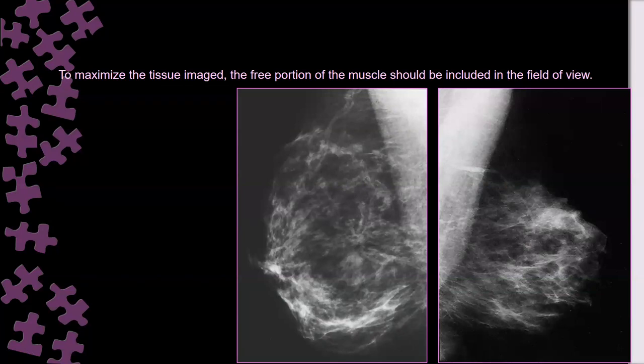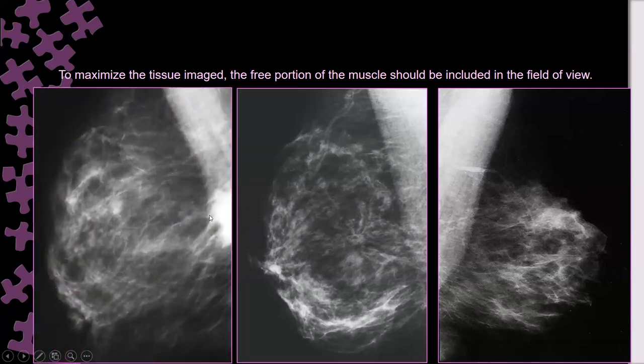Okay. When you look here, is it an optimum MLO? We might say maybe yes, maybe a little bit, not maximum optimum, especially on the right side. Okay? A little bit narrow, the pectoralis muscles here. When they repeat, can you see? By pulling more, relaxing the pectoralis, look here, there is cancer deep posterior.